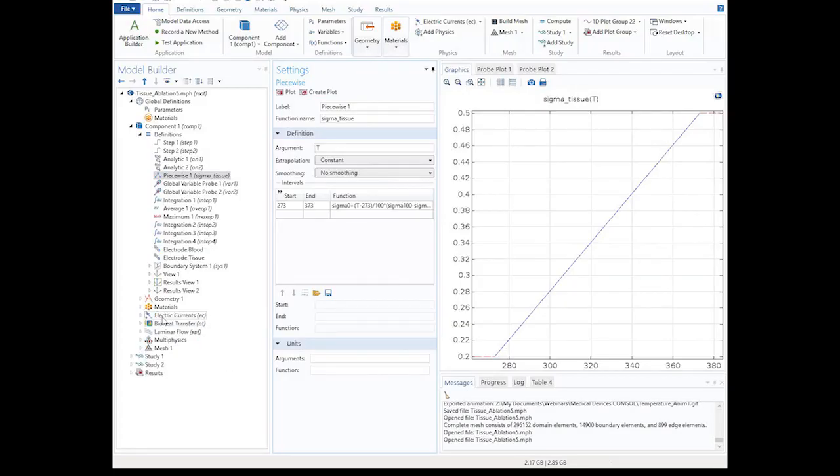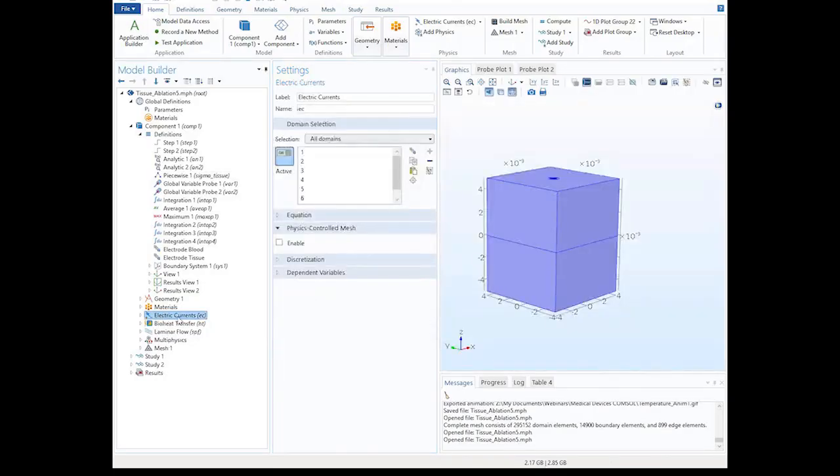So that's the material properties. Next thing is the electric current. There are three physics: current, heat, and laminar flow. Electric current is applied everywhere, so that's all shaded blue here.